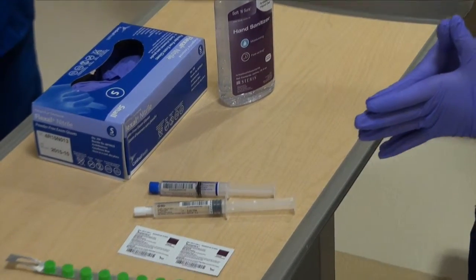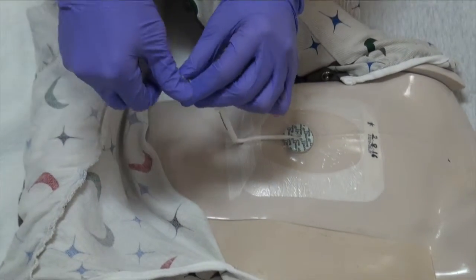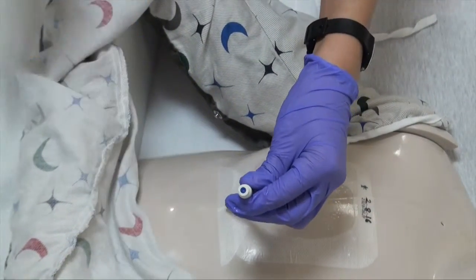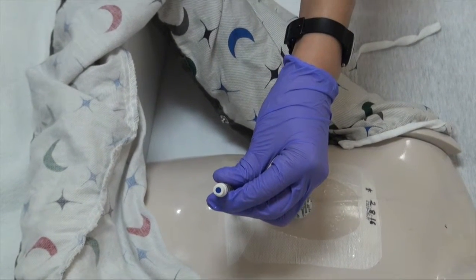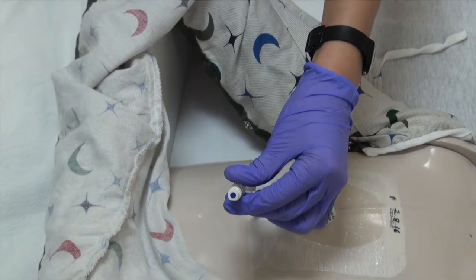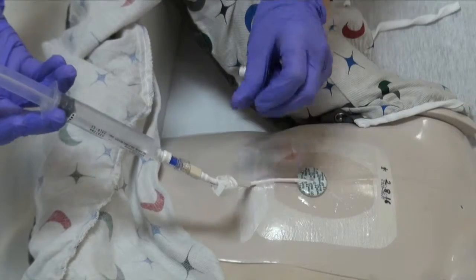Clean the cap of 1 lumen with a CHG wipe for at least 30 seconds and allow to dry. Do not blow or wave over the cap to decrease drying time. Do not allow the cap to touch any clothes or dressing while it is uncapped after being cleaned. You want to flush with the central line sodium chloride. Make sure to unclamp the line, flush, and reclamp the line.